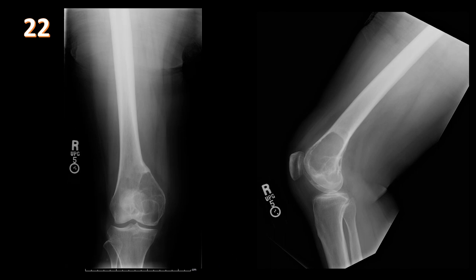AP and lateral views of the knee show a lucent bubbly lesion centered at the epiphysis of the medial femoral condyle with three characteristic findings of giant cell tumor: epiphyseal location, expansile lucent lesion, and well-defined non-sclerotic borders abutting the epiphysis in a patient with a closed growth plate. GCT is benign but can metastasize; treatment is curettage and packing, but recurrence occurs in up to 40% of cases. Differential for epiphyseal lesions includes chondroblastoma (open growth plate, pediatric), infection/tuberculosis, and in adults clear cell chondrosarcoma.